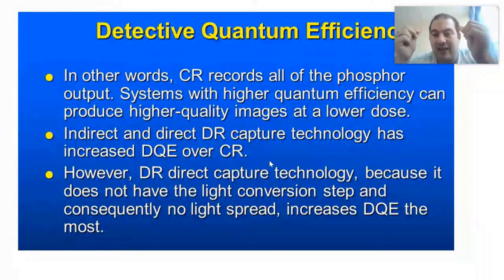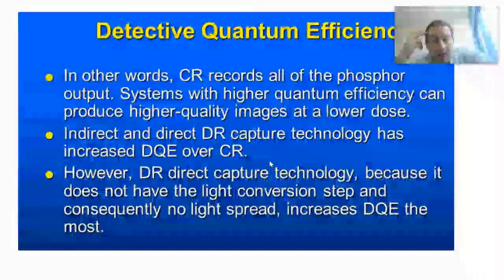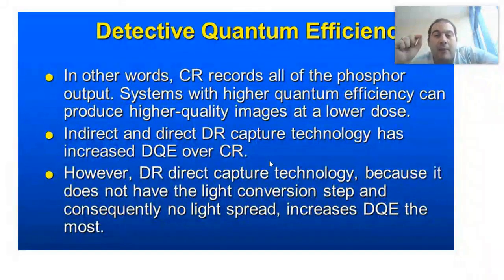However, you may find that the details of the abdomen and intestine are not distinct, making it difficult to perform the assessment. If you always give a high dose to the patient, it means high count or high detection. In this case, the image is very clear, which means your detection efficiency is high. But what about the resolution?